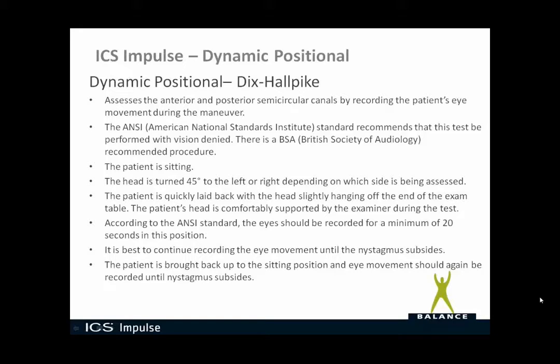This test assesses the anterior and posterior semicircular canals by recording the patient's eye movement during the maneuver. The ANSI standard, or American National Standards Institute, recommends that this test be performed with vision denied. I also want to mention that the British Society of Audiology also has a recommended procedure for the Dix-Hallpike. So the patient is sitting, and as I'm talking through how the test is performed, we're going to show you a video of a patient actually being positioned into these different positional tests.